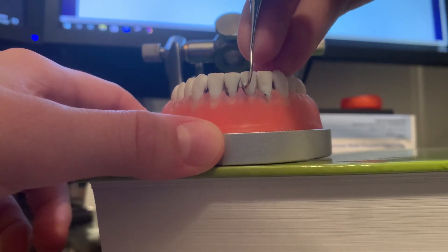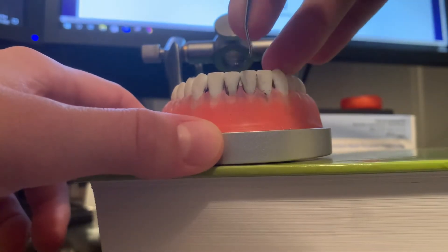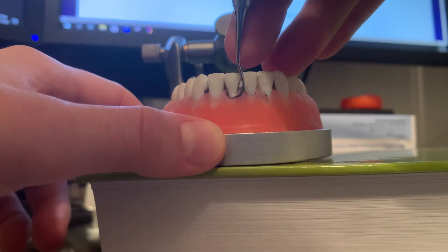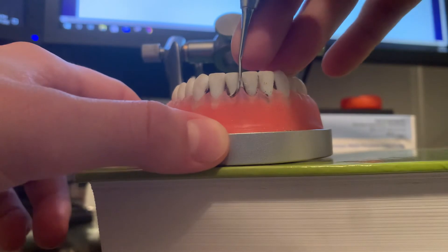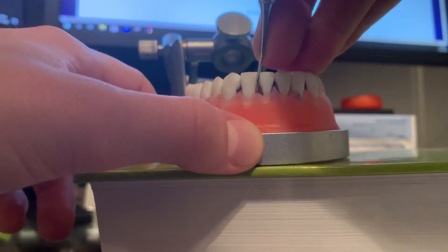Making sure I turn into that contact. Take it out, reposition on the next tooth and roll into that distal contact.